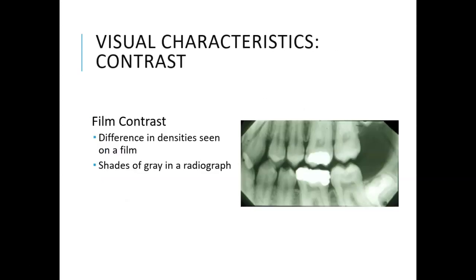Film contrast. Now we're going to talk about contrast. Contrast is the difference in densities seen on the film, the shades of gray in a radiograph. So now we're talking about all the variations between the extremes of white and black, and all the shades of gray in between.